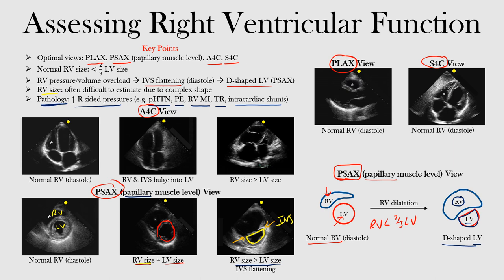Next we have the apical four chamber view. Notice the star highlighting the right ventricle. This is your left ventricle, this would be your left atrium, and this would be your right atrium — you can see the valves between them as well. Between the right atrium and right ventricle is the tricuspid valve, and then this would be the mitral valve. Our focus here is the right ventricle — that's normal diastole of the right ventricle.